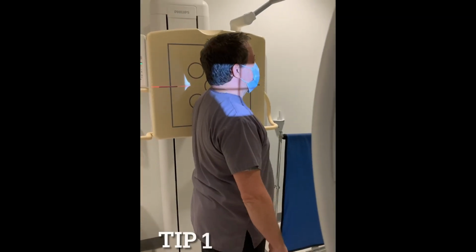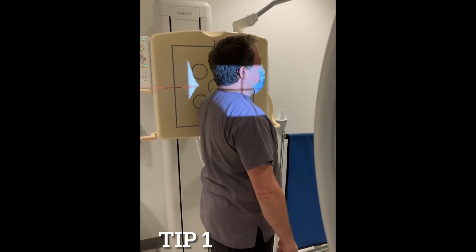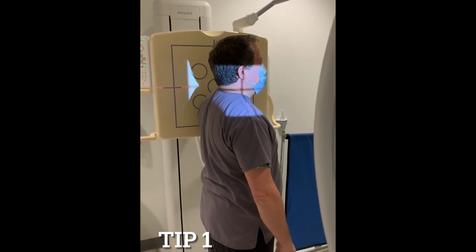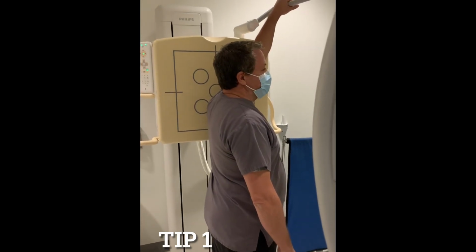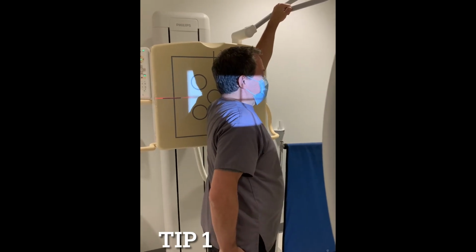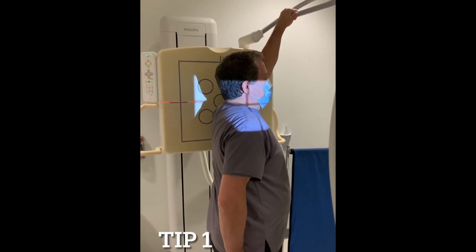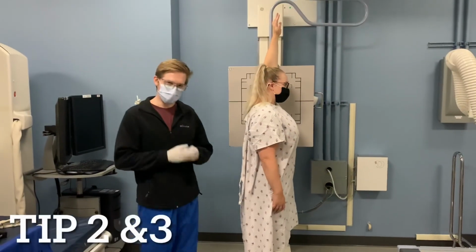Okay, so for a positioning tip on the swimmer's view, you can get your bucky and tube in alignment into place, and then give the patient the handle here for support for their arm. And then once they're into position, it's easier for them to hold still. Now they're ready to dive on into the swimmer's view.